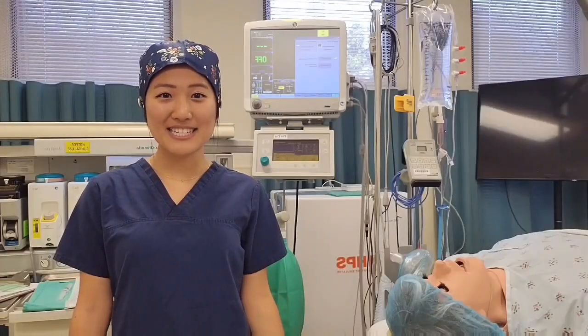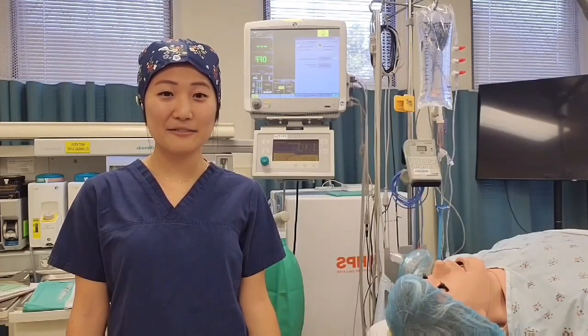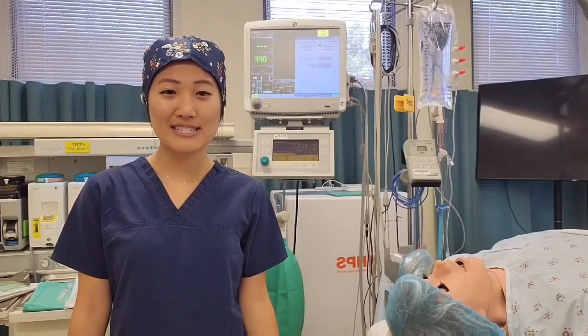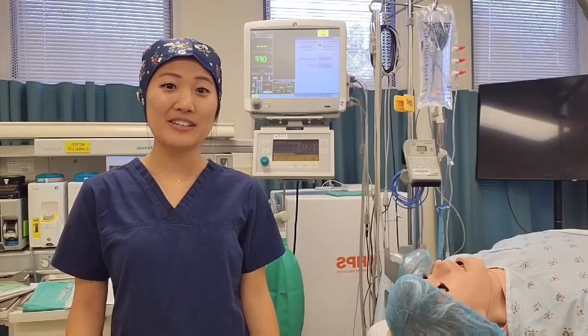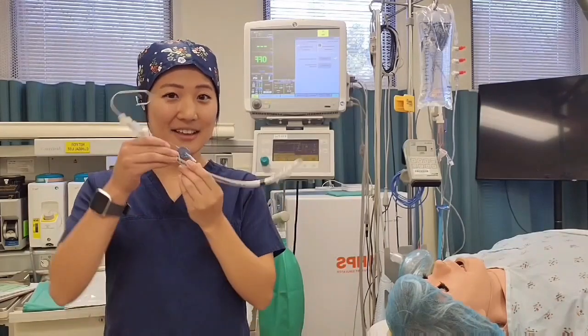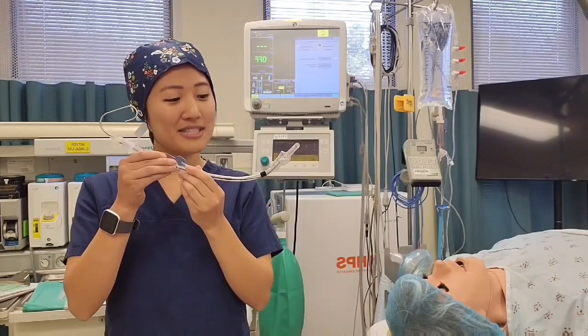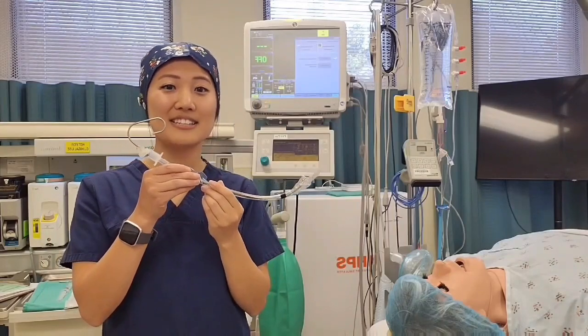When intubating a patient, it is important to get a clear view of the airways and to also manipulate your endotracheal tube to get the angle you want in order to aim it in between the vocal cords and into the trachea.